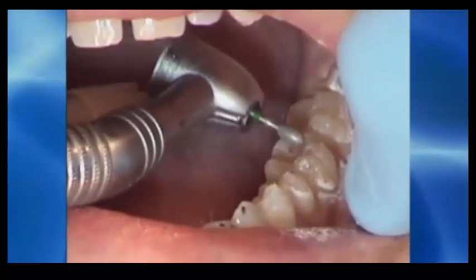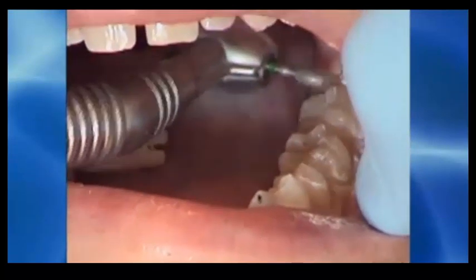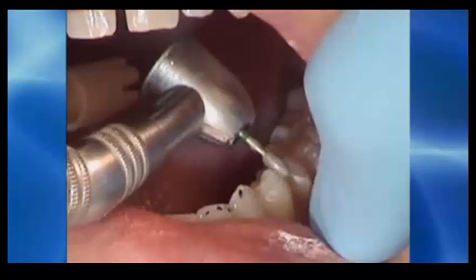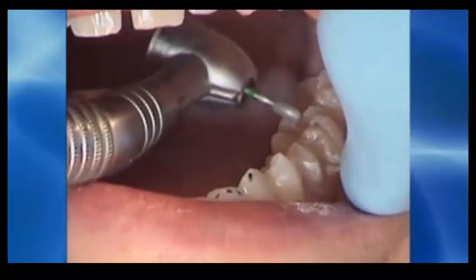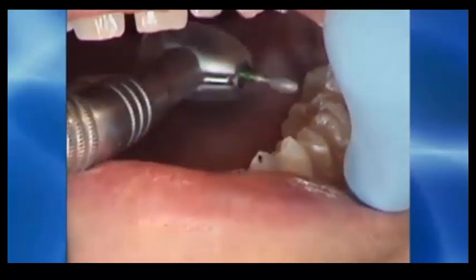Here I am trimming around this central fossa contact on the lower first molar and also the balancing incline again on the lower second molar, and once again on the buccal aspect of the premolars, trying to bring these contacts to be very small in size with very little inconsistent markings around them, all of those markings being removed.